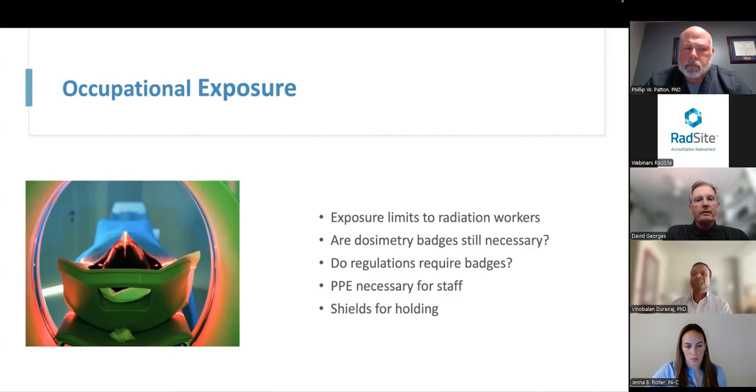Sure. Yes, Vino, and I think the easiest explanation that I can provide is that when we deliver a system, it's a two-part system. We have the table that the patient lies on. That table is completely shielded, and the only part of the body that is exposed is the breast. So there's no other parts of the body that are being exposed to the primary beam.